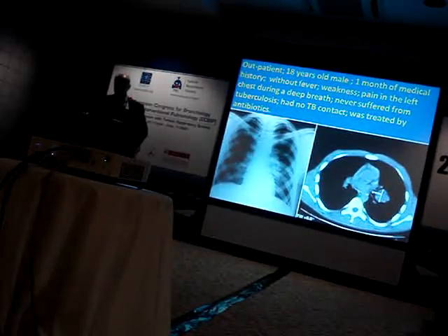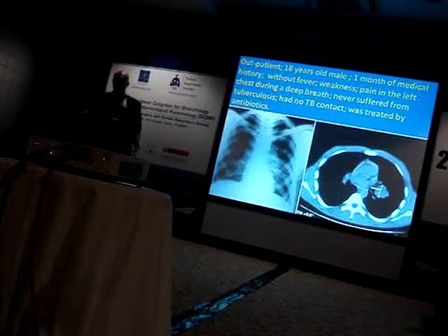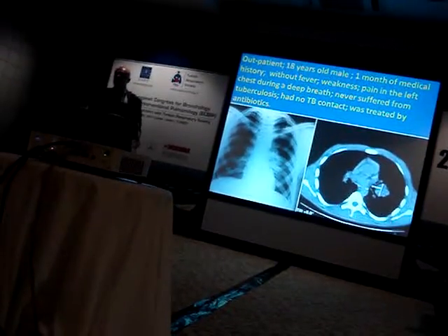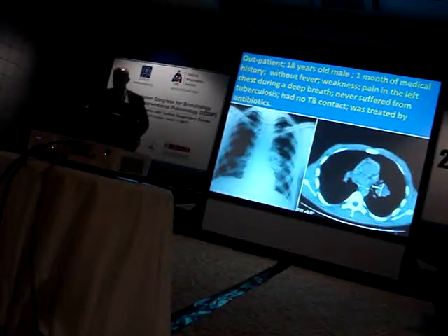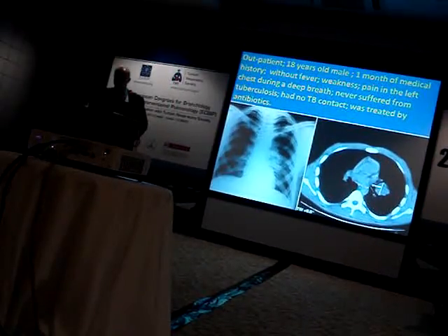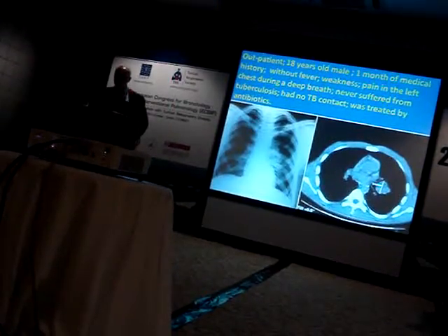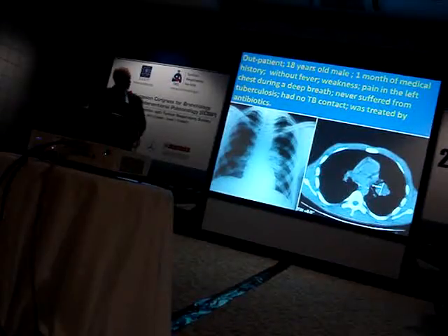Next case, an 18-year-old male patient with 1 month of medical history. His initial diagnosis was lymphoma. He complained of intense pain in the left chest. We performed bronchoscopy and diagnosed TB. MTBDRplus detected the MTB complex in BAL.